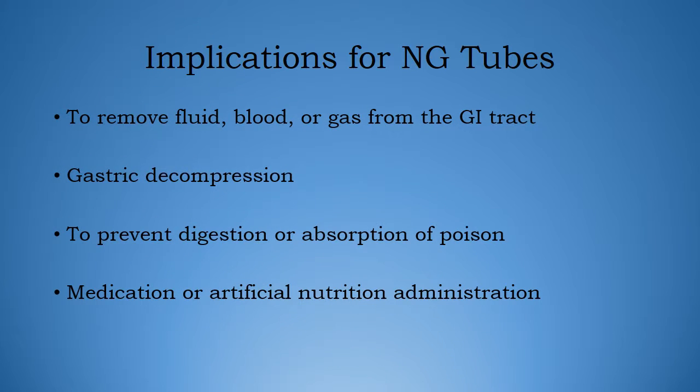Implications for NG tubes are to remove fluid, blood, or gas from the GI tract, gastric decompression for conditions such as pancreatitis, prevent digestion or absorption of poison, medication or artificial nutrition administration.